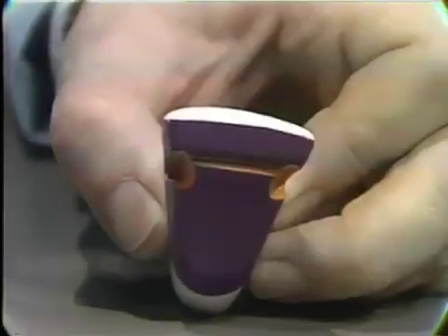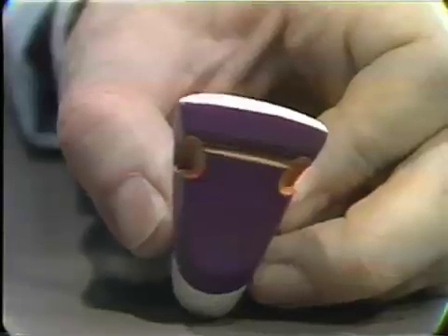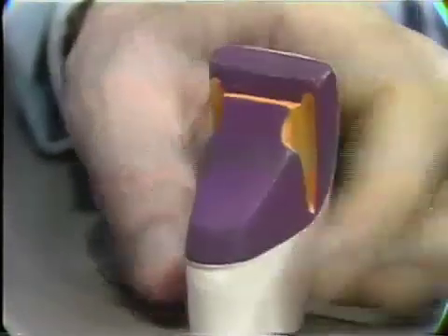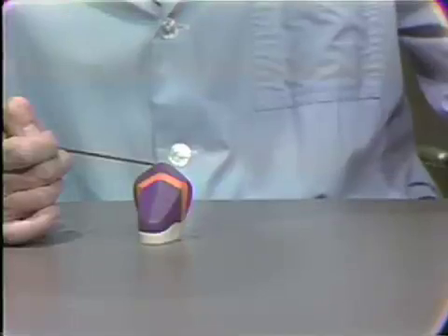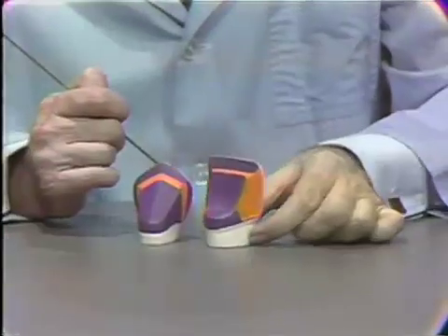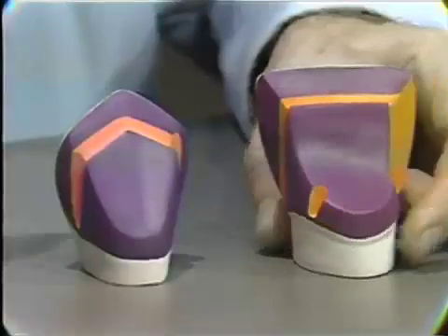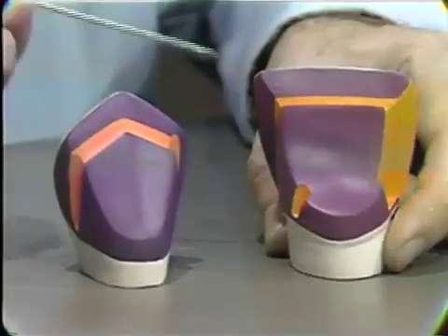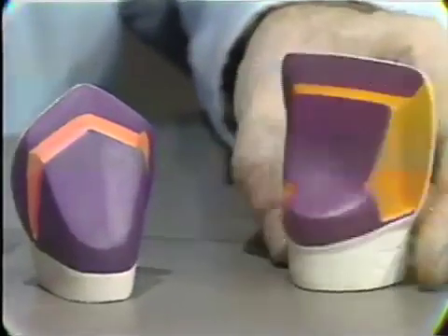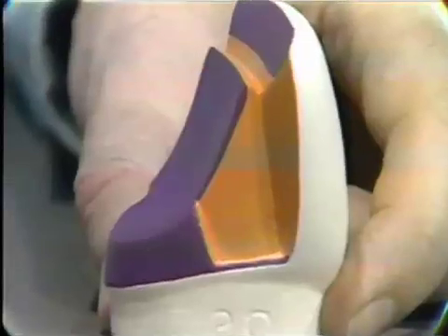But here again, this type of preparation would probably be replaced by a pin ledge in current practice. You should, however, be familiar with these because you may come across bridges that have been in position for some years in which this type of preparation has been used, and you find yourself having to work with it and to repair it. Another modification of the standard three-quarter crown preparation is shown here, in which a box replaces one of the proximal grooves.